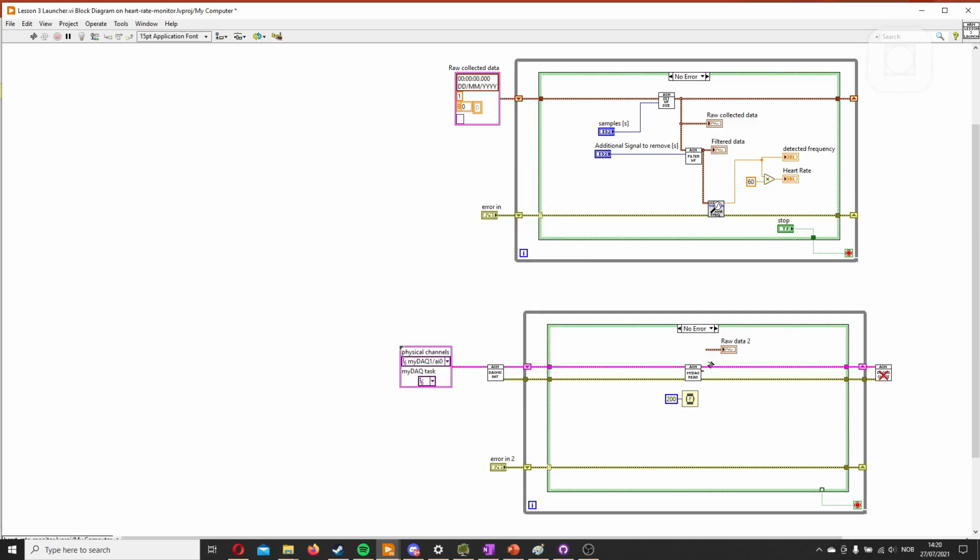What we need now is for the data in this wire to go up here. It might look like you could just do this.